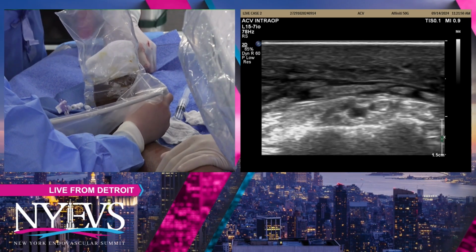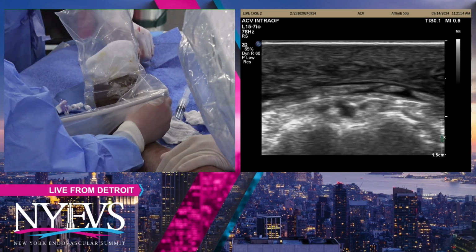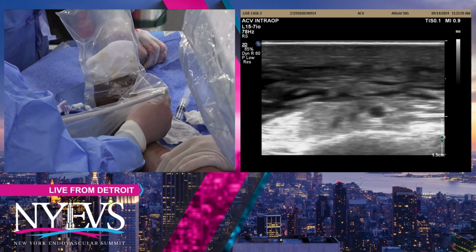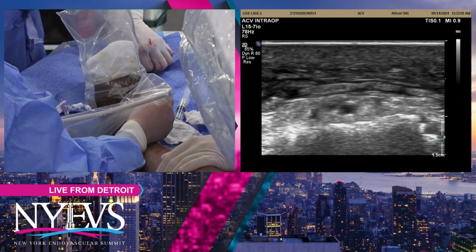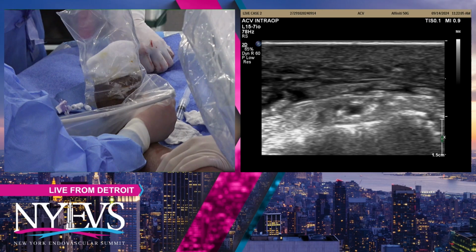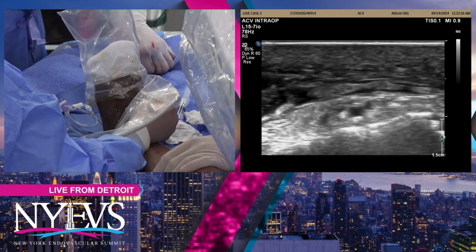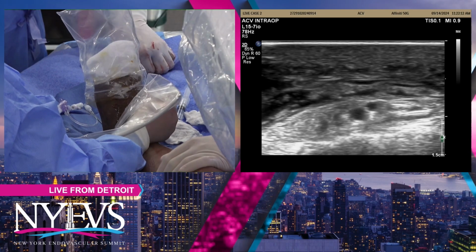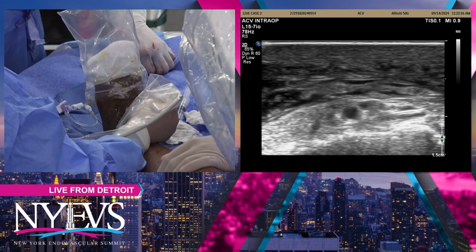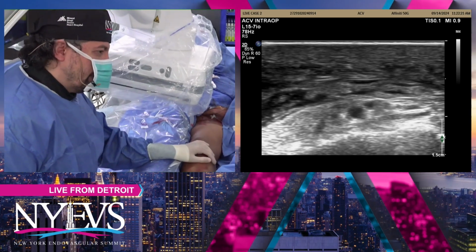You touched on one of the lectures that I give, which is about the role of extravascular ultrasound, or EVAS, in the treatment of PAD and CLI patients. And I think obtaining access is just the introduction to the use of ultrasound. Ultrasound is important in tackling CTOs, monitoring CTOs, decreasing radiation, decreasing contrast volume, and ultimately making sure that we have hemostasis and choosing closure devices.